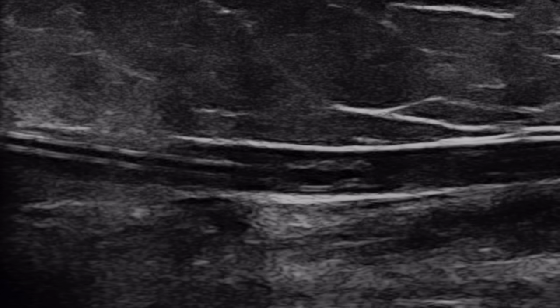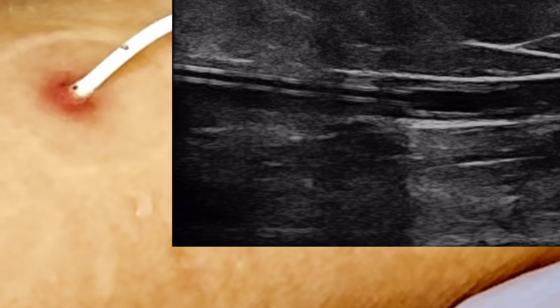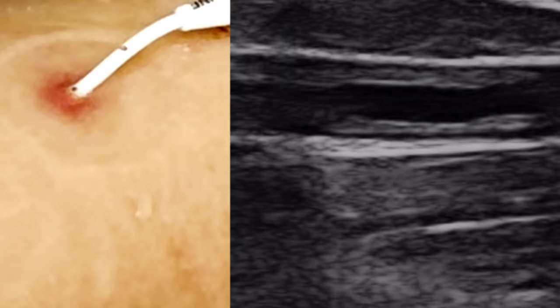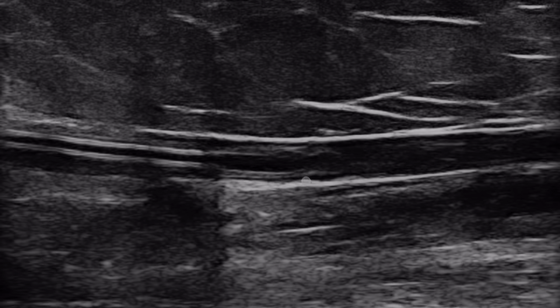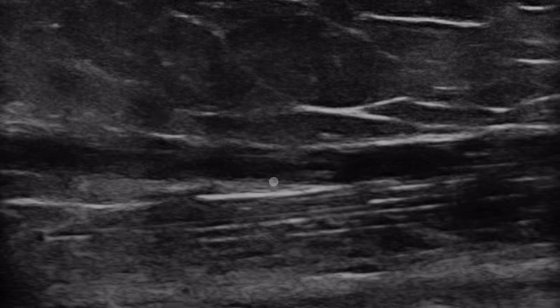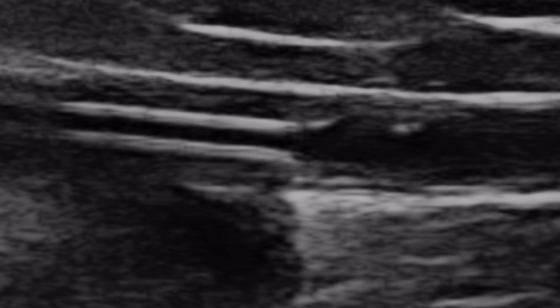What I'm going to do is flush and see what happens. Look at that — the catheter tip is actually terminating here. This hyperechoic luminal structure is actually the fibrin tail — watch it move forward as I flush. That fibrin tail is moving forward. Do you guys see that? That expansion of the fibrin sheath?